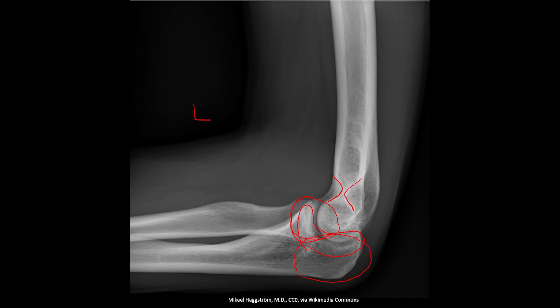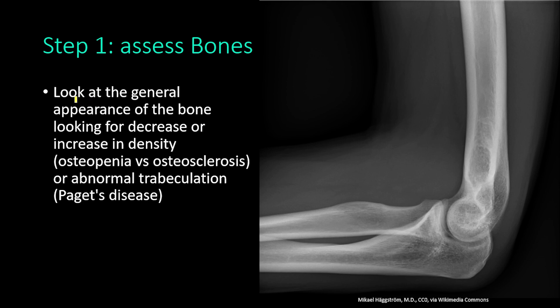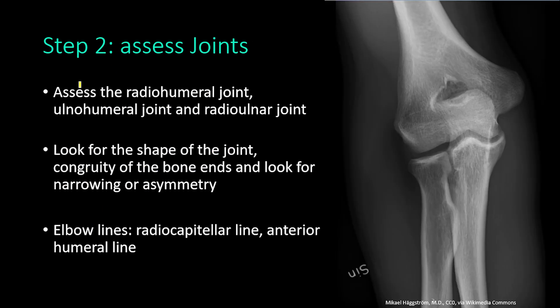After checking those for fractures, you also check the edges of the rest of the bones — the edges of the humerus, radius, and ulna. In assessment of the bones, you also look at the general appearance: osteopenia is a decrease in density, osteosclerosis is an increase in density, and you look for abnormal trabeculation such as in Paget's disease.